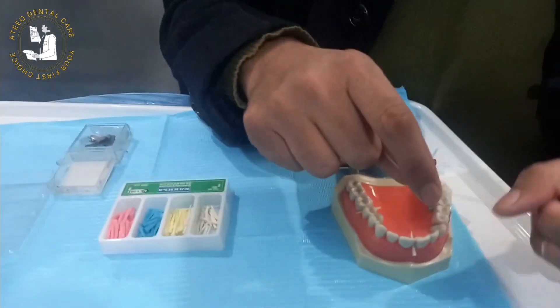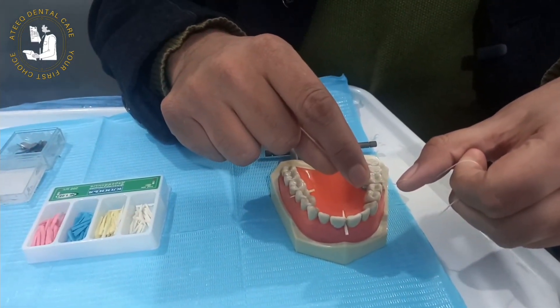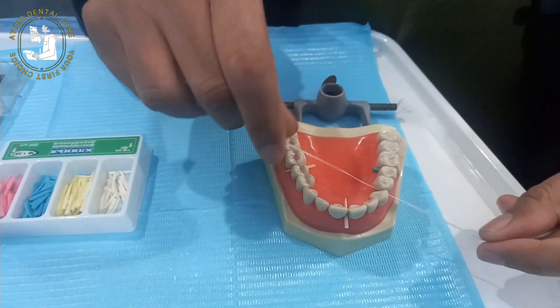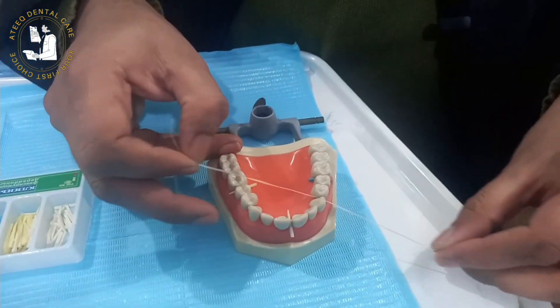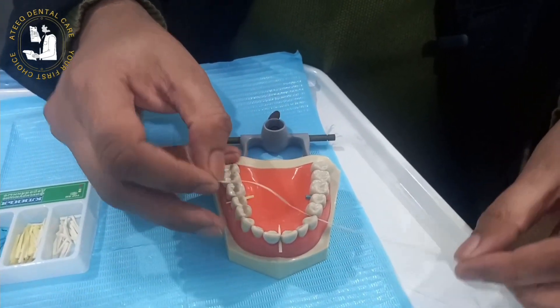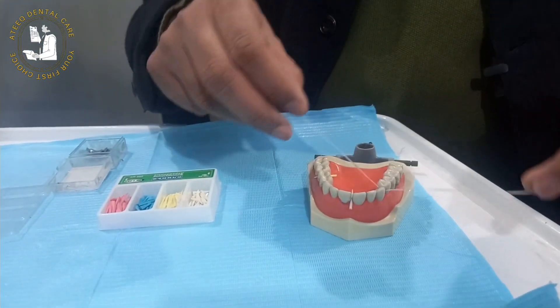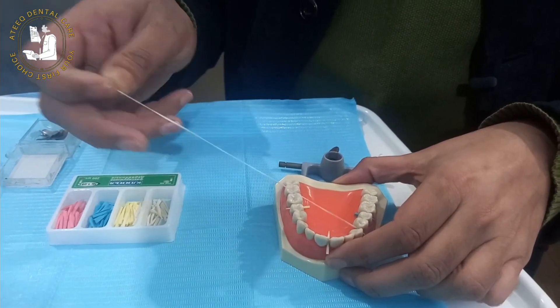The first step in checking the teeth contacts is with the help of dental floss. We have to check with dental floss whether the contacts are tight or not. Between the canine and premolar, we are checking first. A clicking sound is there — a snapping through the floss below the contact point. We can wrap around it to check the contact point. This is the method to check the contact width of the teeth or restoration. The contacts are fine in this case.